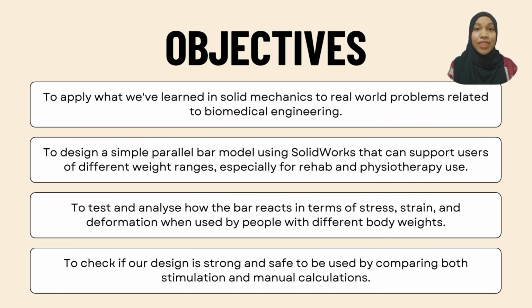The objective of our project is to apply solid mechanics in a real-world biomedical context. We designed a simple parallel bar using SolidWorks to support users with different body weight, especially in rehab and physiotherapy setting. We also tested how the bar reacts under various weight in terms of stress, strain, and deformation. Finally, we compared the simulation result with manual calculation to make sure the design is safe and reliable.